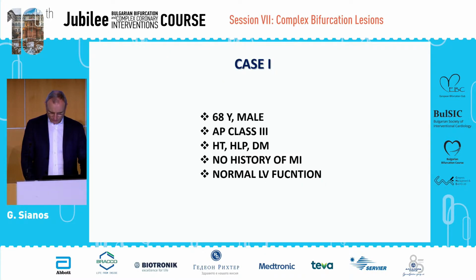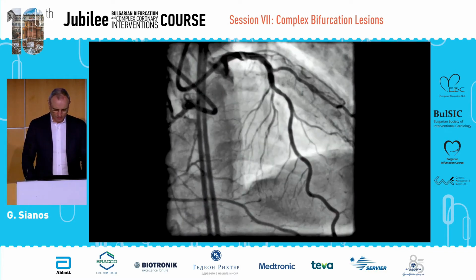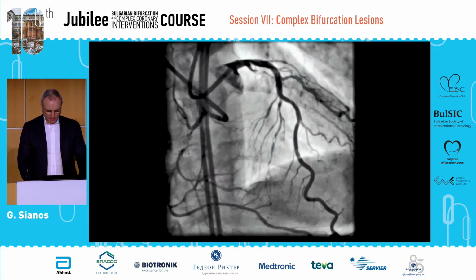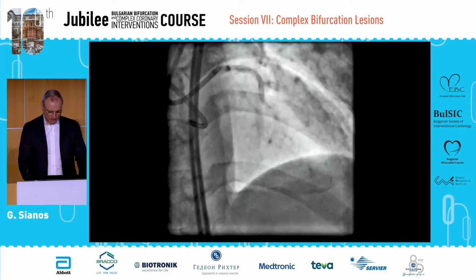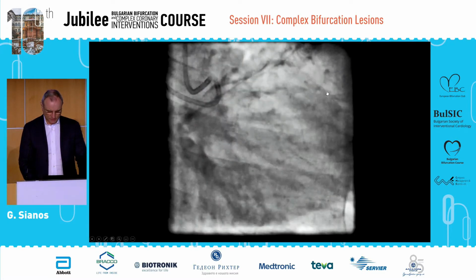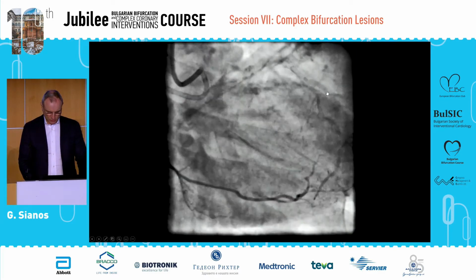When you address this kind of issue, one of the things you have to show is how these patients can be treated, or give a glimpse of what might be involved. You see here a patient that has an occluded circumflex, and it's obvious that it has a CTO that will be addressed as a second vessel. The right is also occluded, as you can appreciate here. The CTO of the circumflex is not yet completely clear. You can see here a big marginal branch and a rather big distal branch for the circumflex.